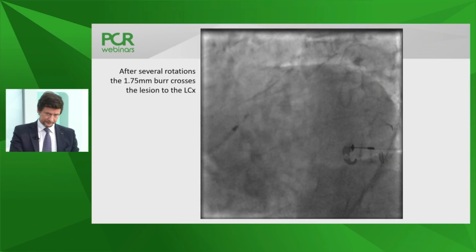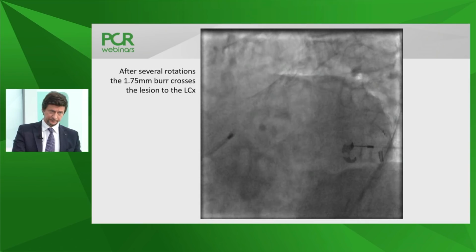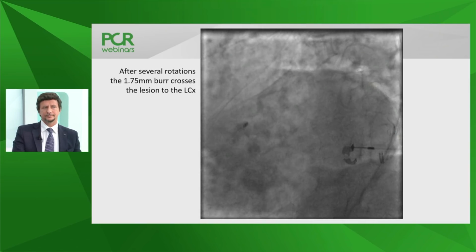Chris, I will not show you a control angiography. We are doing the procedure all together. We want to optimize contrast, but we have seen how the burr moves now. Is there any need to do further plaque modification here?